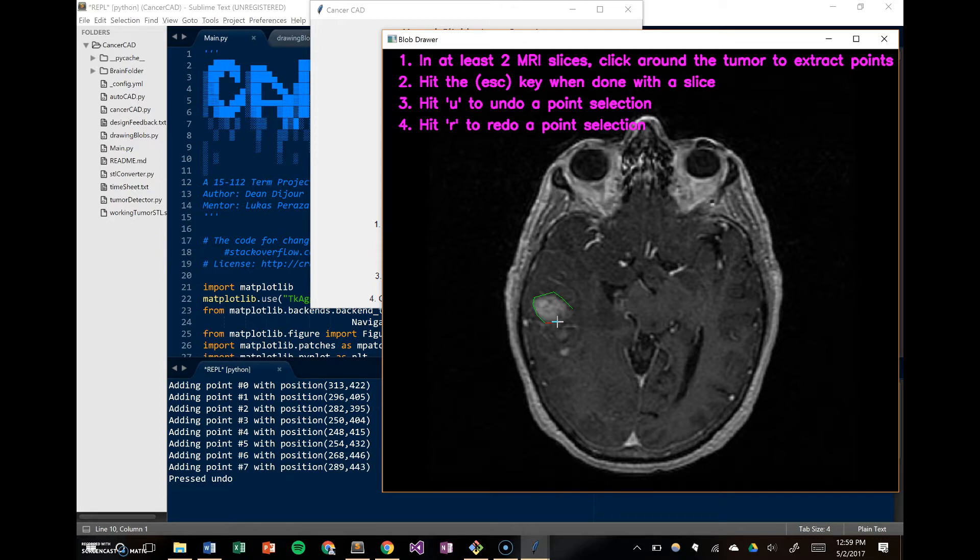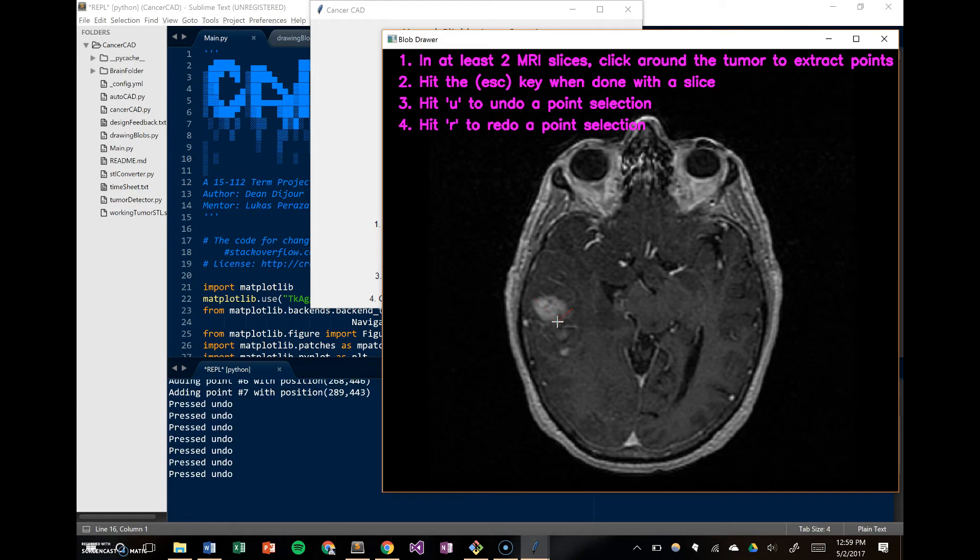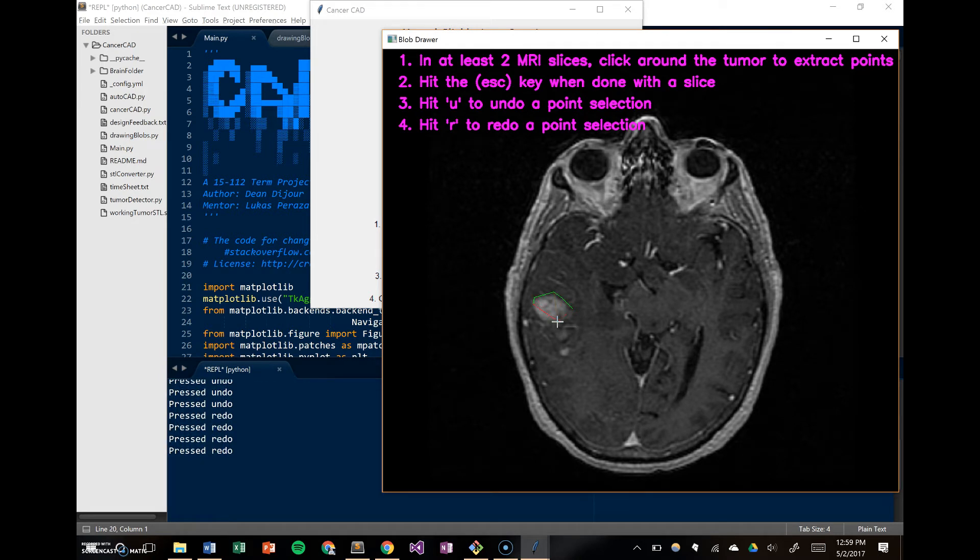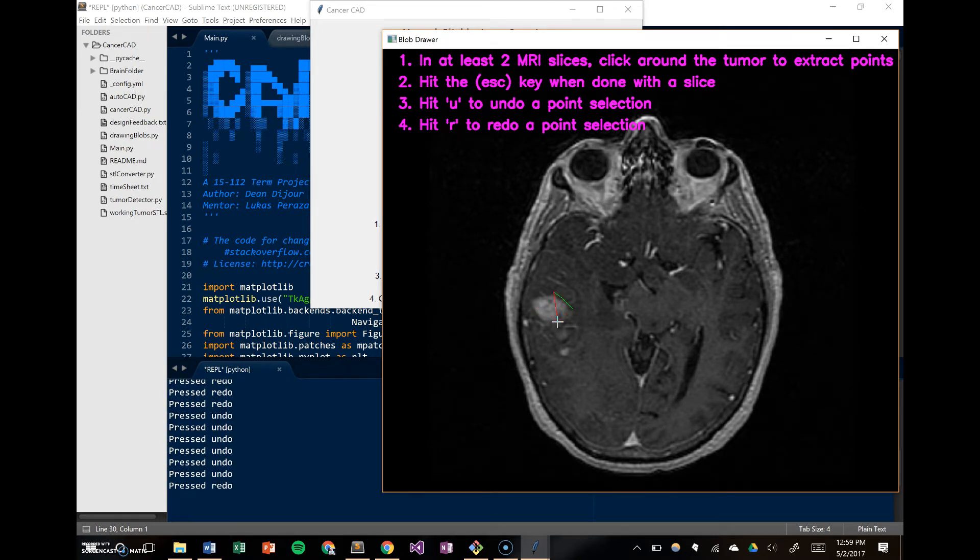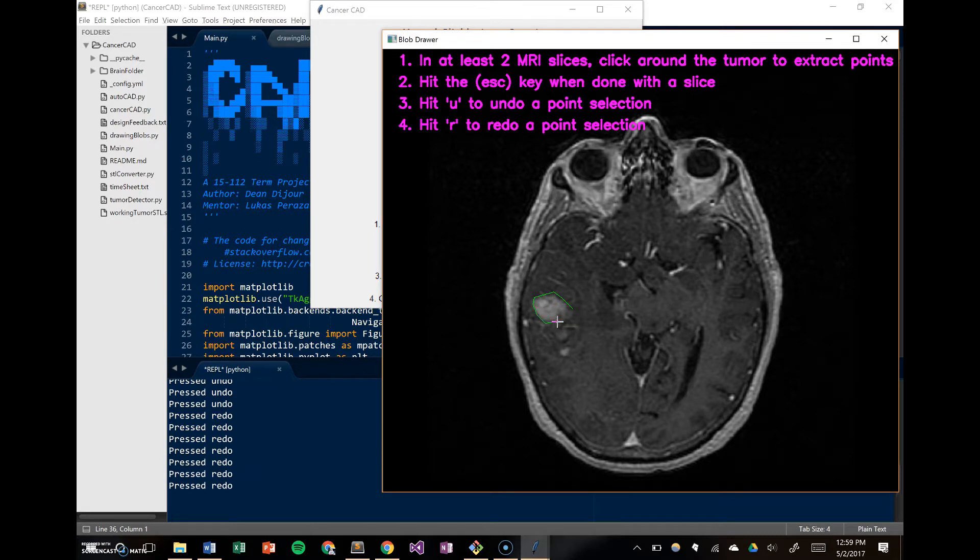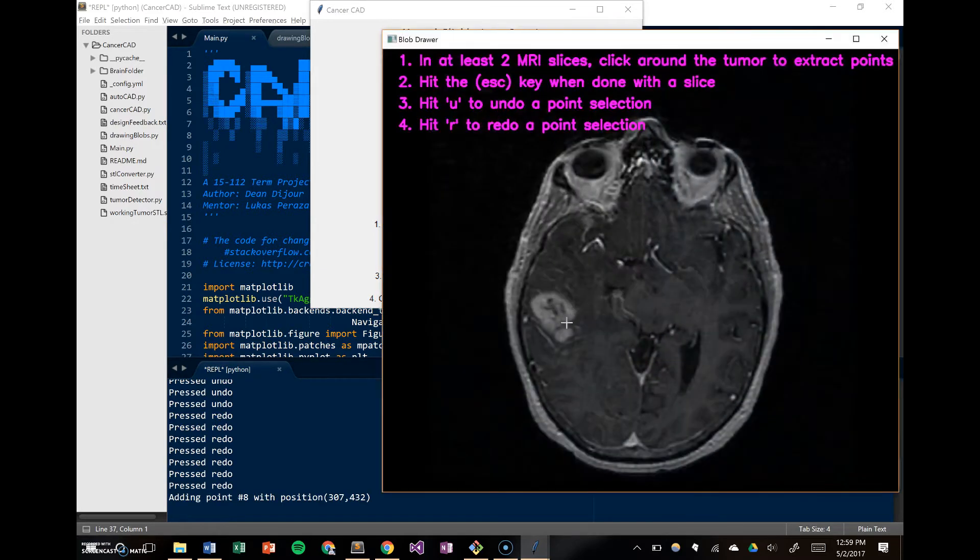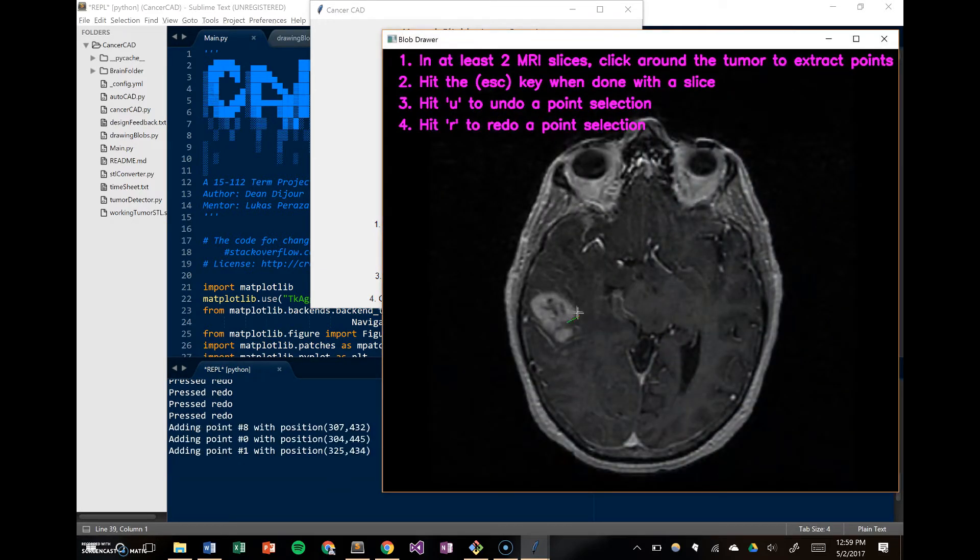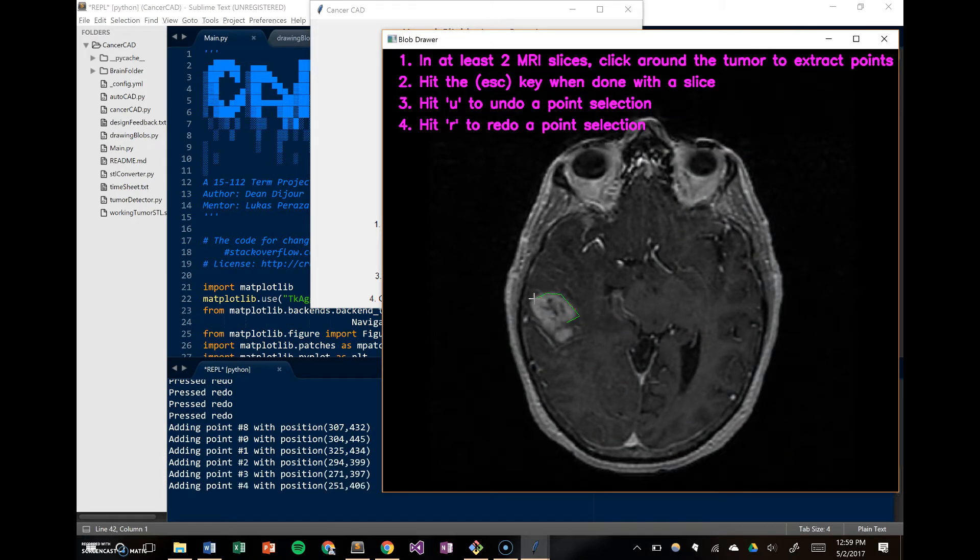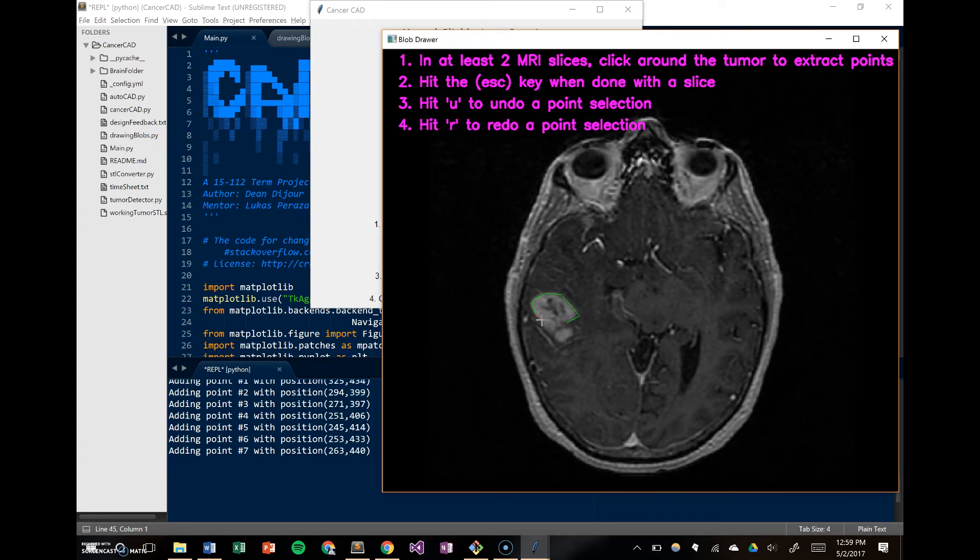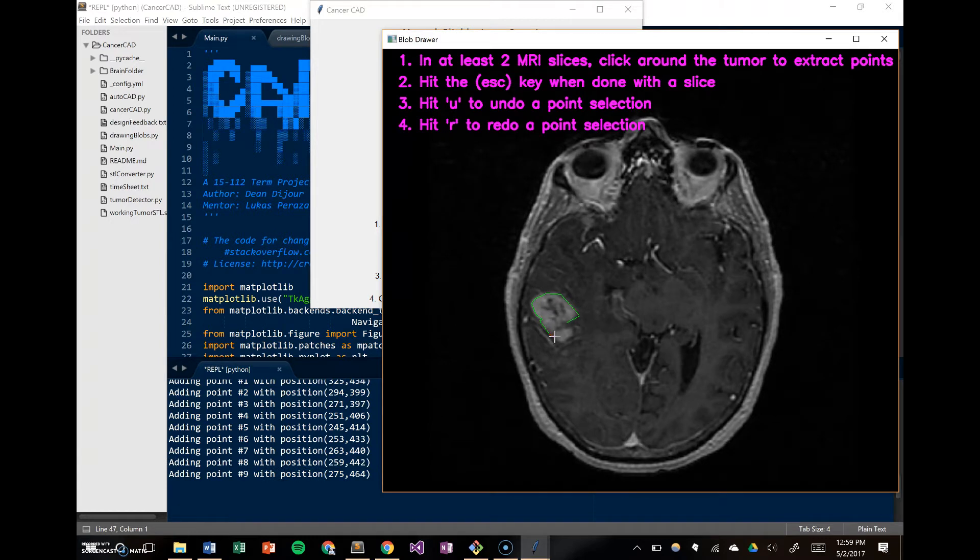Ideally, a doctor would do this in a 10-15 minute time span. I won't do all of them, but it's a pretty simple process. You can undo, you can redo, you can draw the coordinates, and then when you're done with one image, click Escape. It'll highlight it in green, and then you go to the next one. We're only going to do two here, just because the process is very simple.